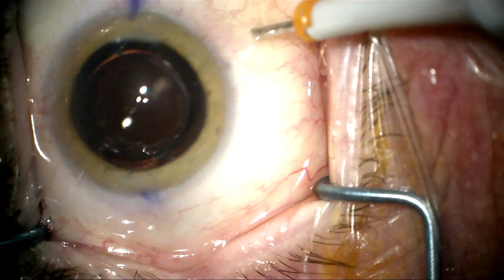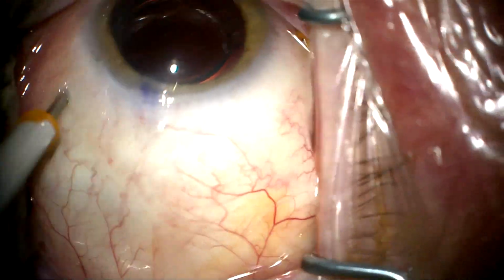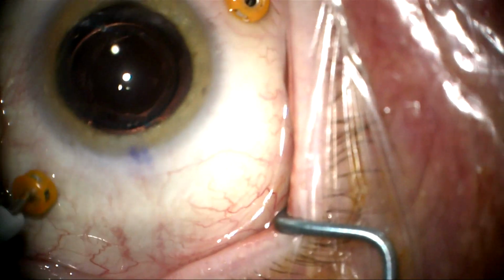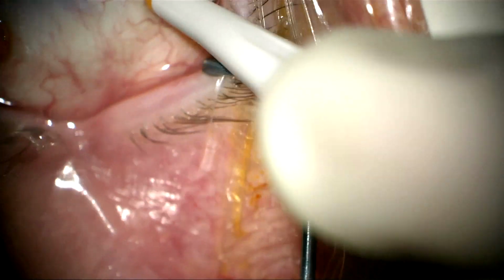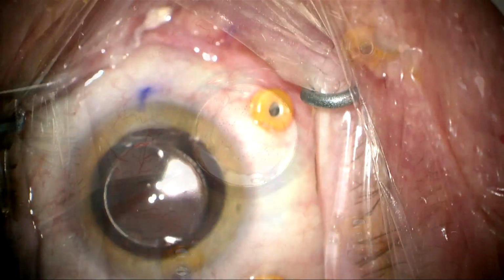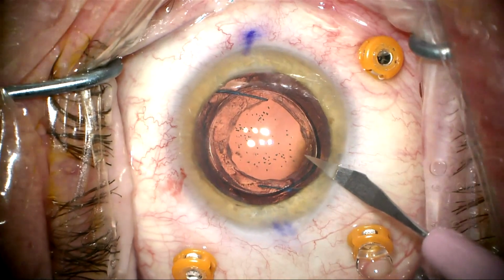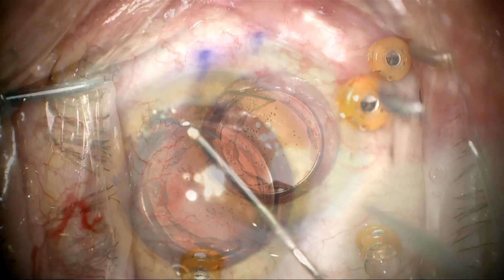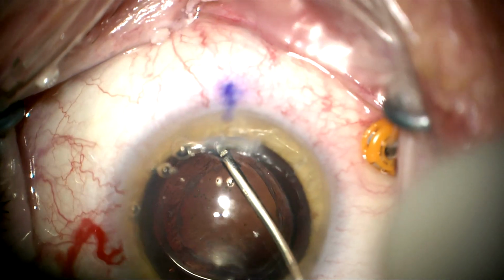Here we're in the OR and we're going to place pars plana trocars at the beginning of the case. These are placed 3.5 millimeters posterior to the limbus. We'll now go ahead and make our paracentesis. The goal is going to be to try to get this lens out and place a toric lens.